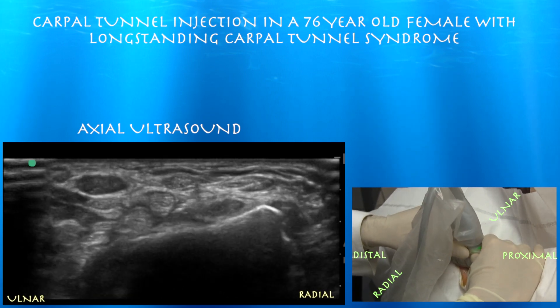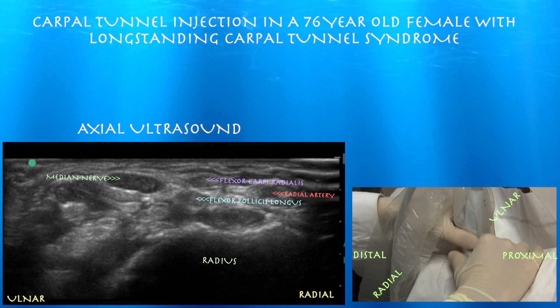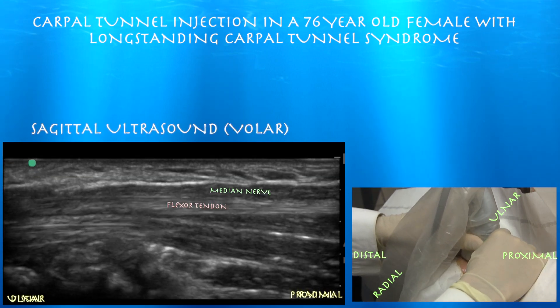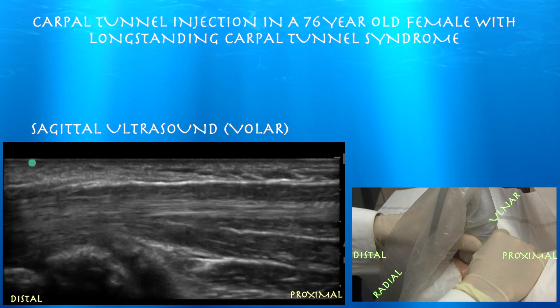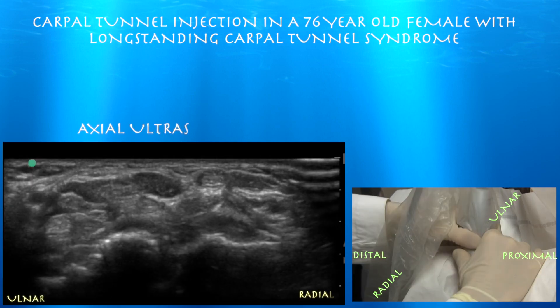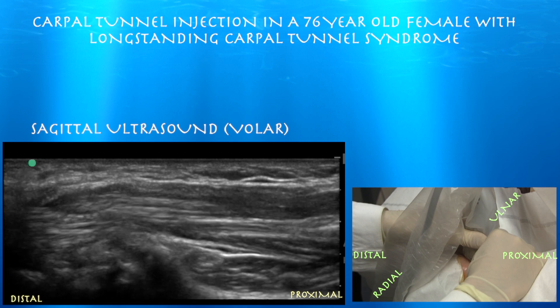One thing you can also check out is the median nerve in long axis. The median nerve is actually very flattened — this lady wound up having surgery, and the median nerve was described as like a little flat worm, just from chronic carpal tunnel syndrome. In long axis, you may look for a notch sign — basically a sign that the nerve gets pinched or thinned distally as it enters the carpal tunnel.